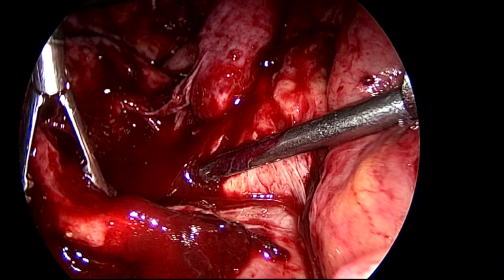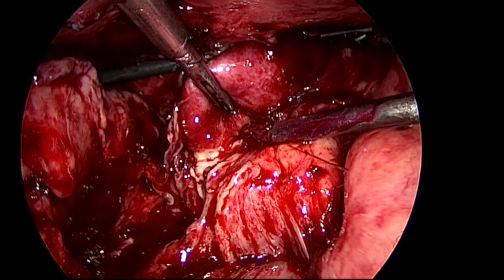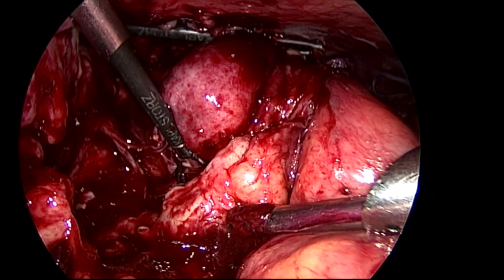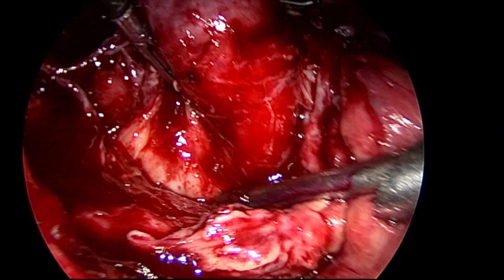So I'm slowly separating the omentum. I feel I'm going through the omentum here. So again, I'm going up. I find the plane. So again, that entire omentum is being pushed down. You have to do it very slowly. Otherwise, you go through the omentum, and bleeding will be there. So our aim is to separate the omental adhesions from the gallbladder.